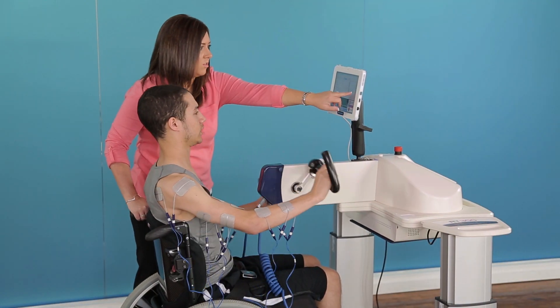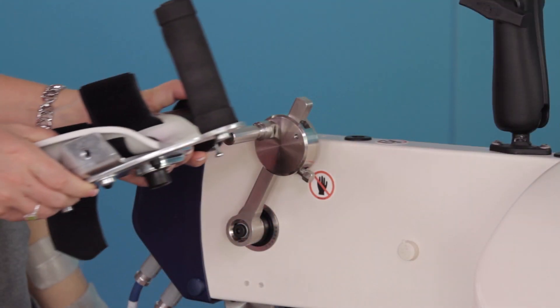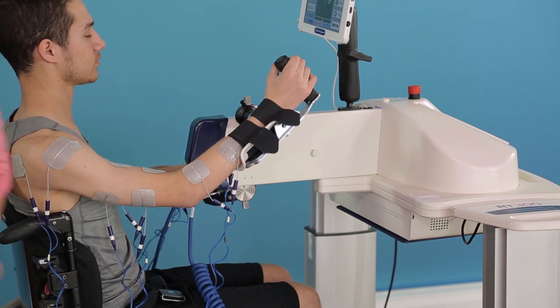These hand grips can be easily swapped out for forearm rests, which provide additional support, as well as a horizontal or vertical hand grip position.